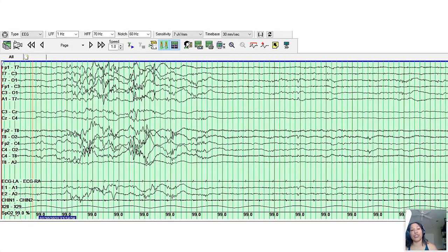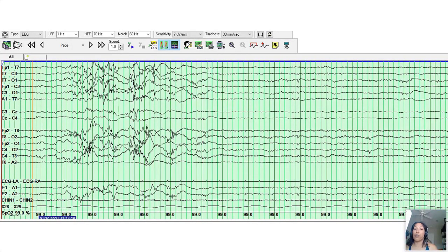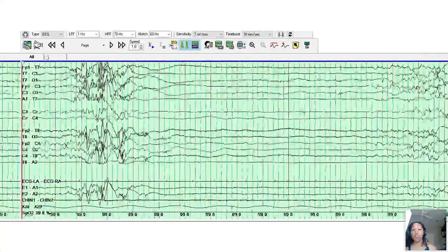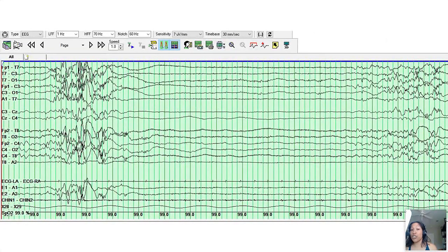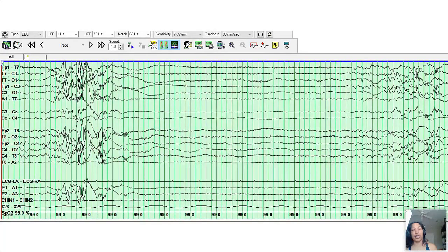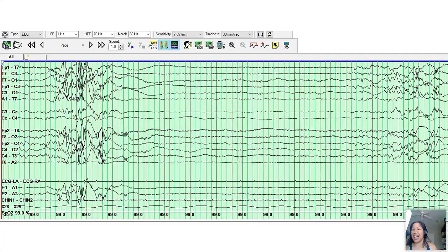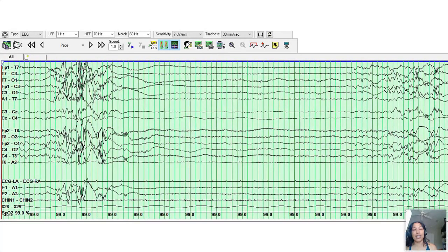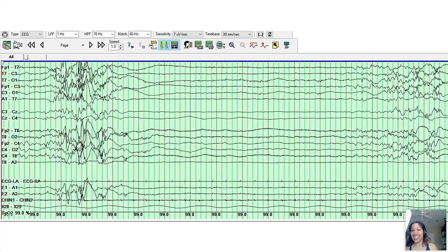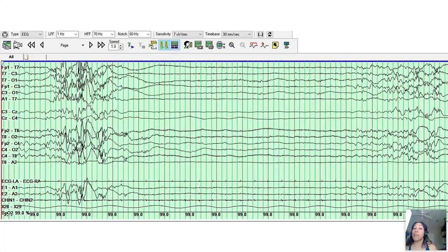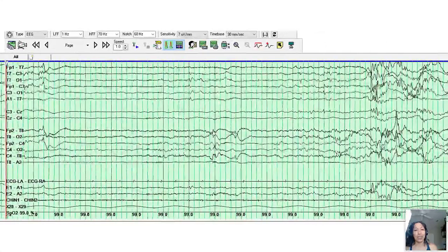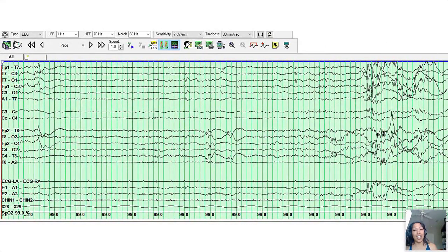And this is something that we could expect to see during sleep in a baby. And I wanted to show this example here because you can count out how long the discontinuity lasts. So I'll count it out: it's about one, two, three, four, five, six, seven, eight, nine to ten seconds or so of discontinuity, and that is about what you are allowed to have in a term infant. So I just wanted to show an example of that.